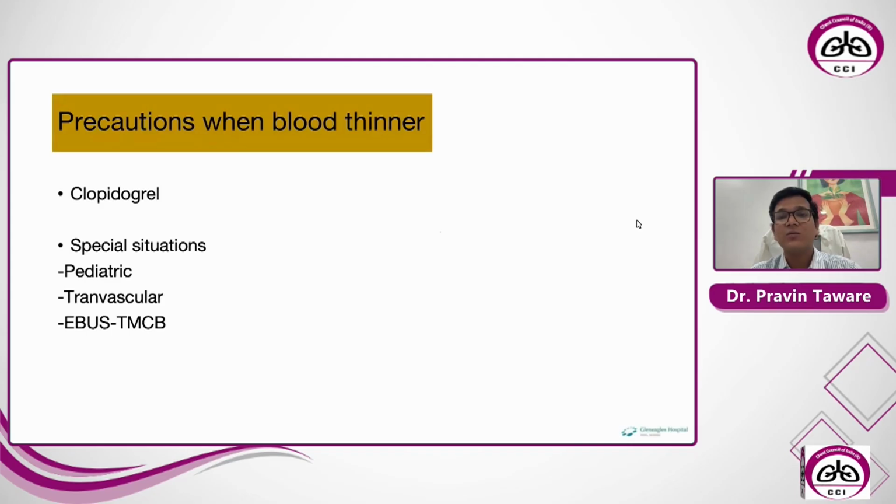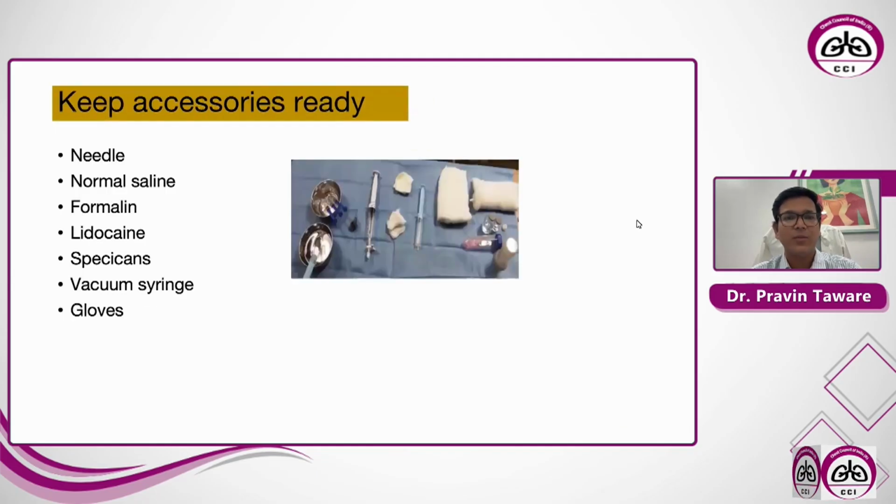Precautions when patients are on blood thinners, specifically clopidogrel. In special situations, you should avoid giving clopidogrel peri-procedure, like if you are doing transvascular, transpulmonary artery or transaortic lymph node biopsies, or EBUS-guided transbronchial mediastinal cryobiopsy.